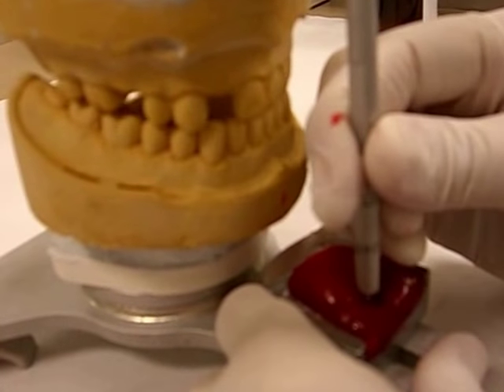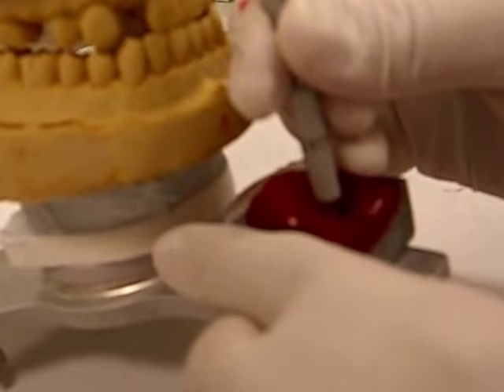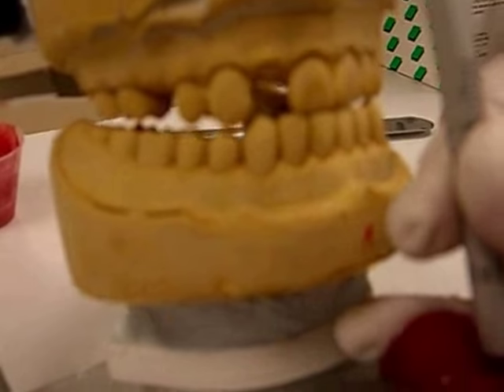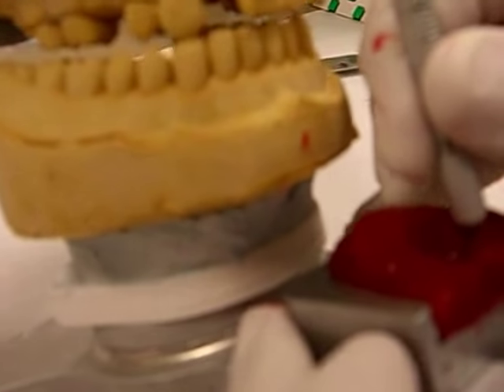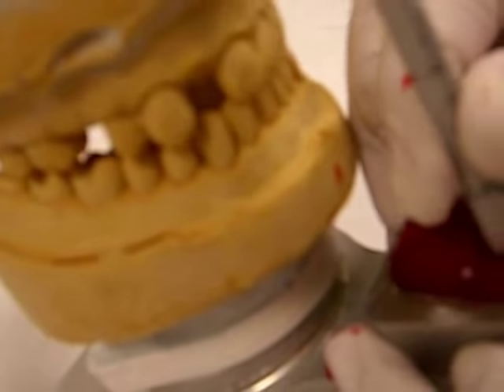When you go into protrusive, how far are you? Edge to edge. In this particular cast, we only get edge to edge on number 8 — number 9 is not long enough, but that's how the patient is. We're all the way to the canines, tip to tip. The same on the other side.